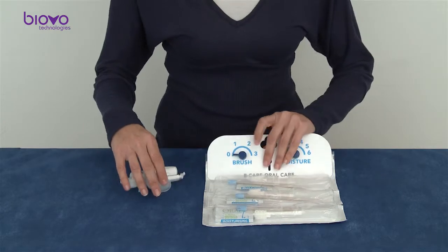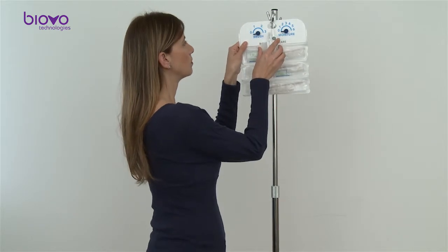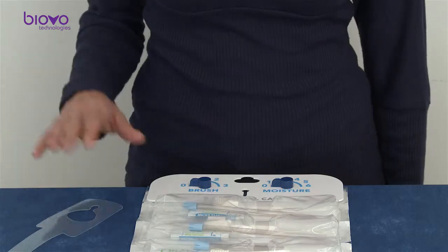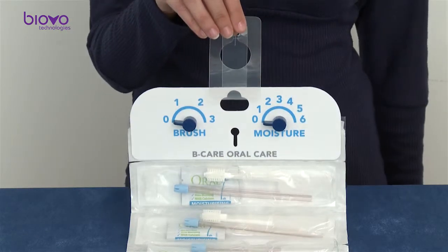On the first day of patient treatment, take the full kit. If using a bedside hanger, hang the kit board on it. The BeeCare can also be hung on a bed rail or an IV pole using the plastic hanger.